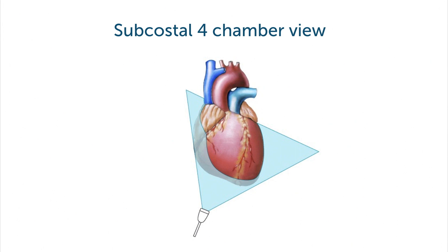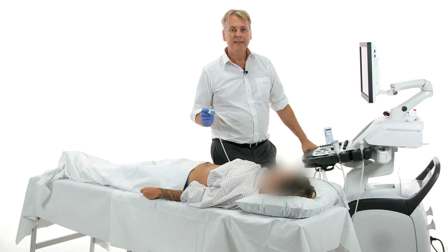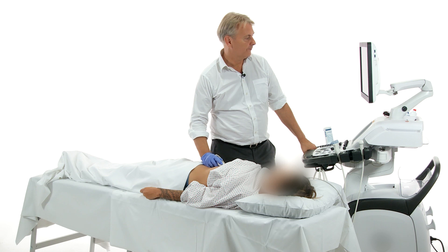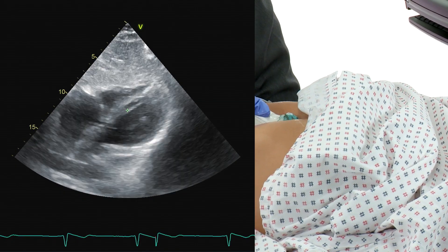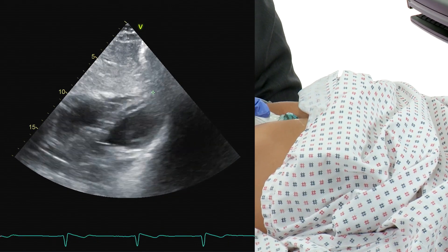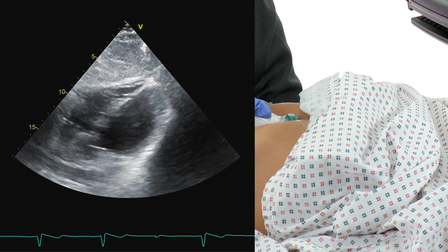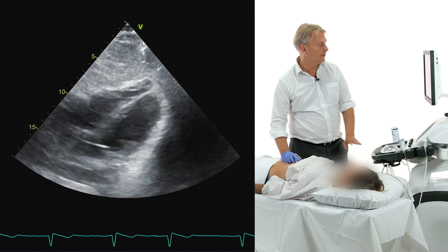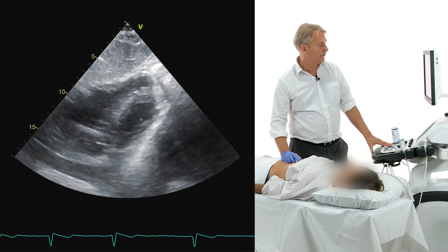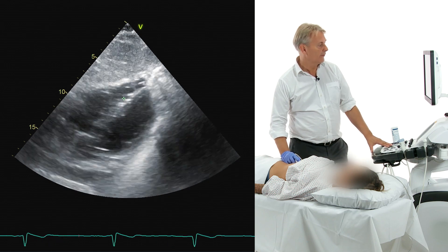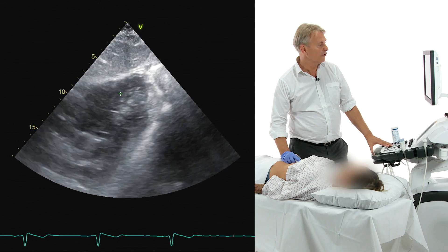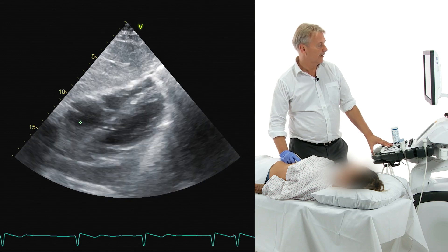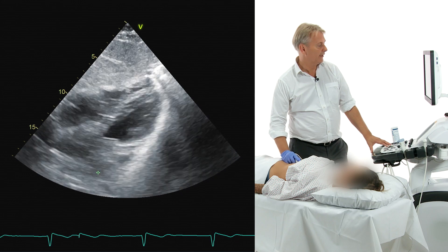Now to the four chamber view. Let's take a closer look at the four chamber view from a subcostal window. It looks quite similar to the apical four chamber view, only that the septum is now oriented more towards the right. This is because we are imaging from a medial position. You have the left ventricle here and the right ventricle right here, closer to the transducer. This is the right atrium, and here we have the left atrium.